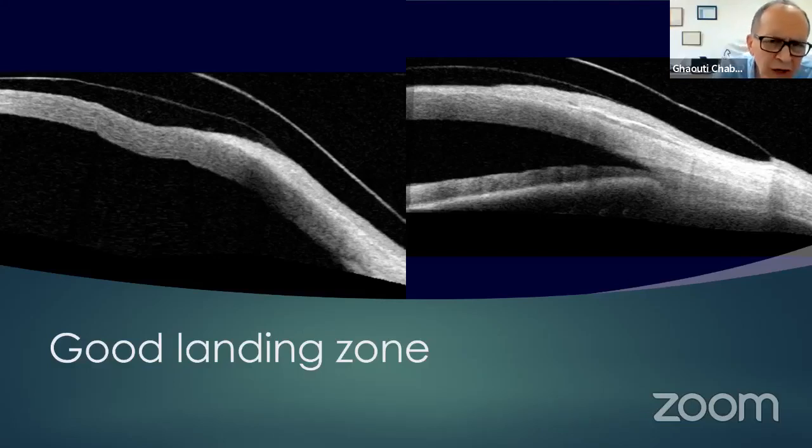Most of the time, when you're using the iPrint Pro impression, do you have to send the lens back again? Well, I don't send the lens back. If I need more clearance, I'll just tell the lab I need an extra 100 microns of clearance, or I'm getting some limbal staining, or there is an impression at 3 o'clock or 9 o'clock. I'll take photographs, send the photographs and all the imaging to the lab, and call them on the phone. They're looking at my images and photographs while I'm looking at them, and they understand what I need done. They make up new lenses. We don't send the lenses back.